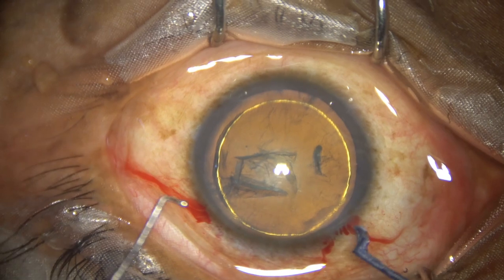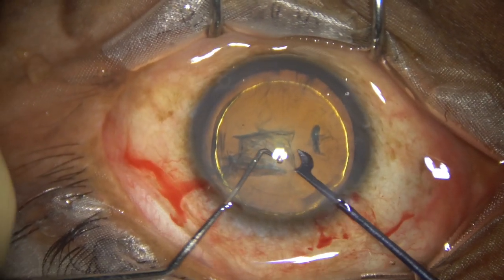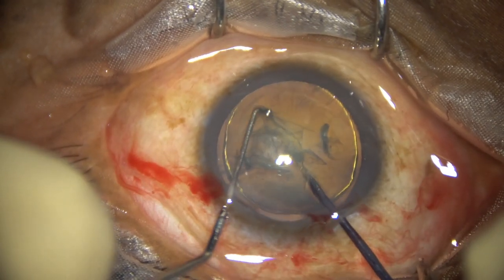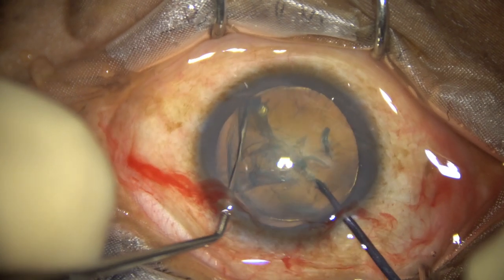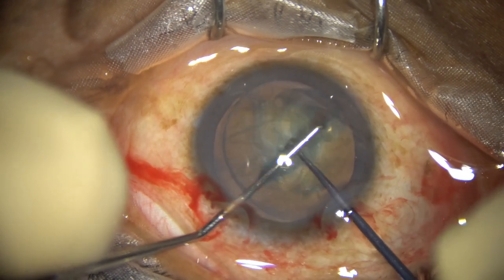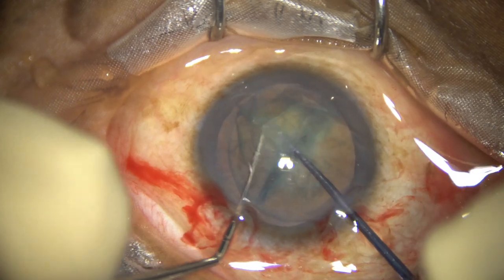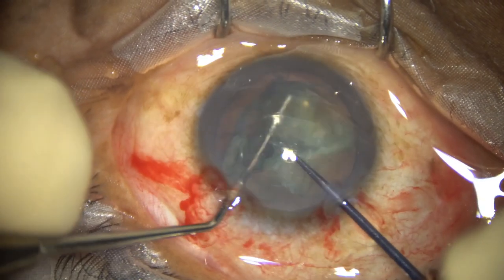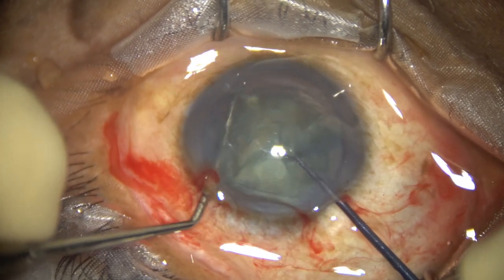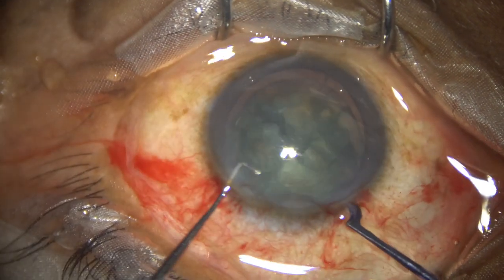Now see the use of this pre-chopper — this is Dr. Sohail Khan's pre-chopper — and how nicely you can pre-chop the nucleus. The nucleus is divided into two halves, and each hemi-nucleus is subdivided into two pieces, giving us four pieces in total.